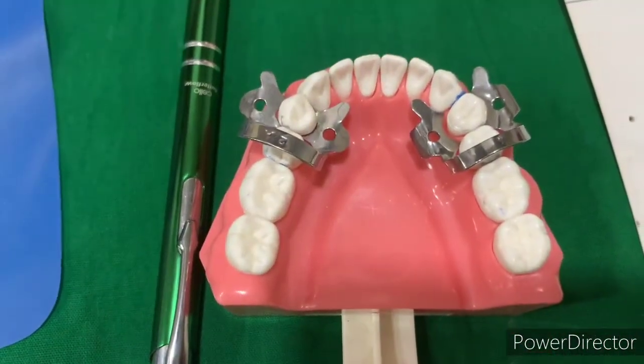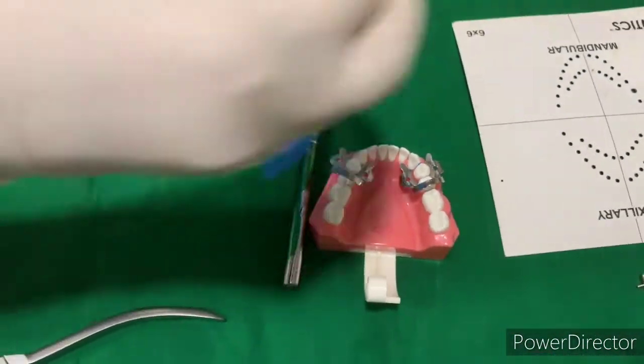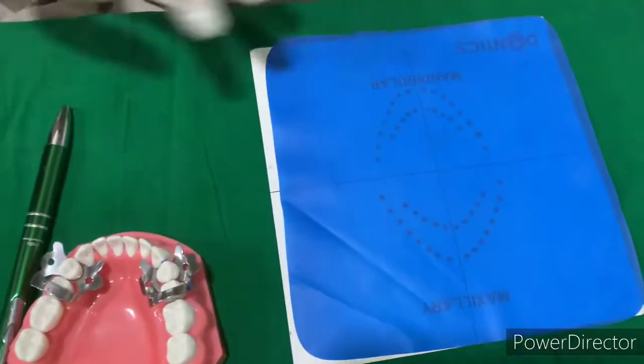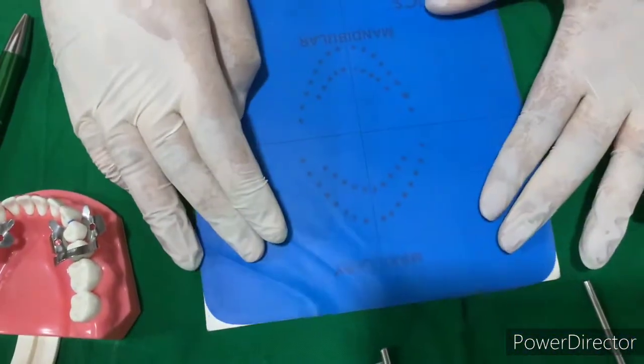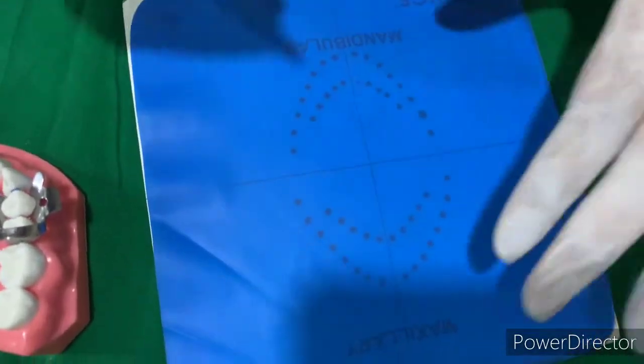Now the selection of clamp is done. We'll mark the tooth numbers on the sheet with this template, from canine to canine.